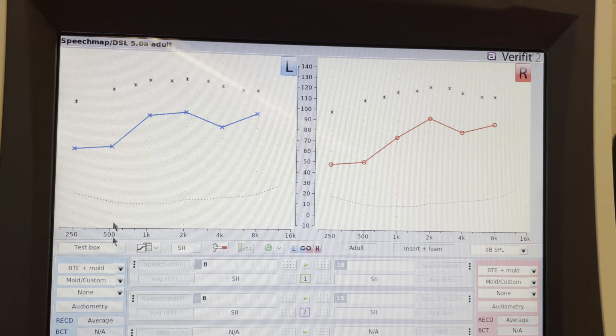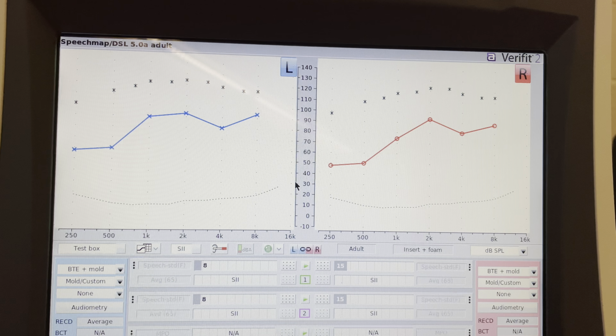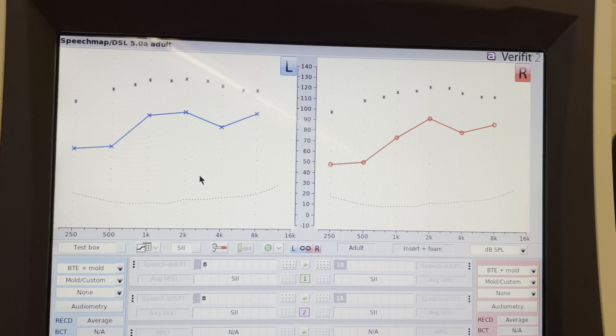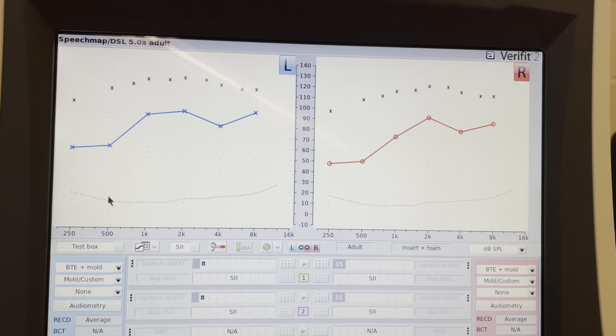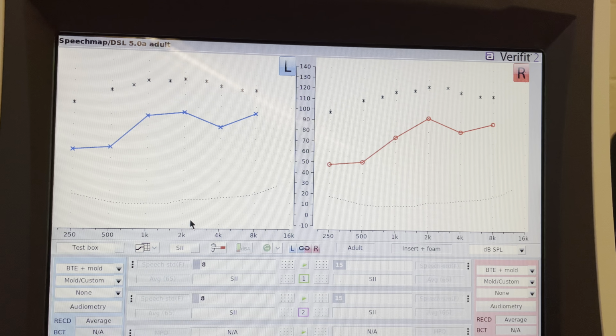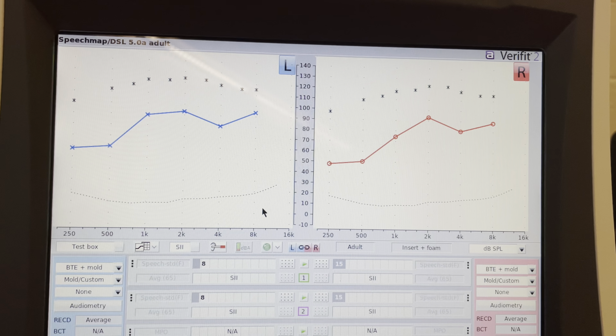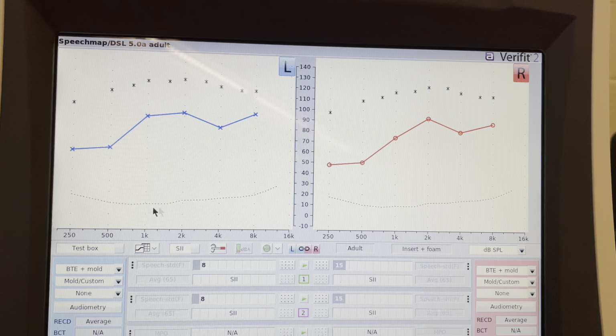So this computer system basically takes that audiogram from 2017, which is the most recent one I have, and I put it into my computer here, and this flips it upside down into an SPLogram just so it's a little bit easier to understand. So this right here is low pitches on the left, middle pitches in the middle, and then high pitches on the right. And then we have soft sounds at the bottom, medium sounds, and very loud sounds at the top. This dotted line is the 0 hearing line for normal hearing.